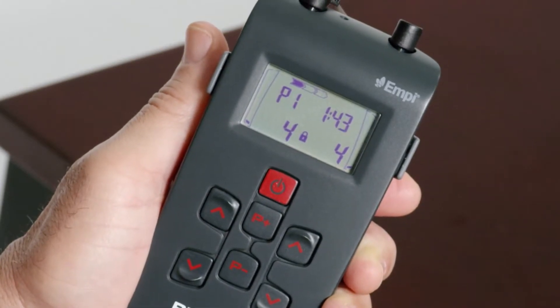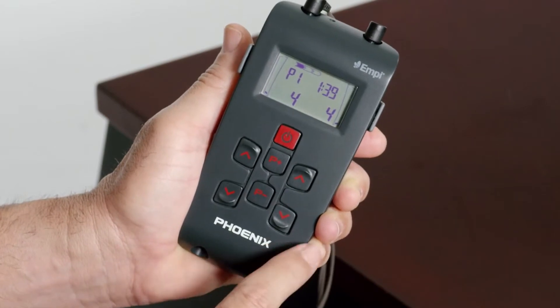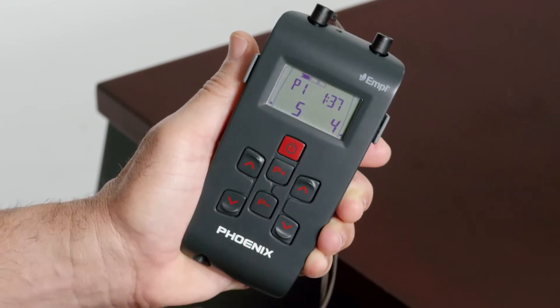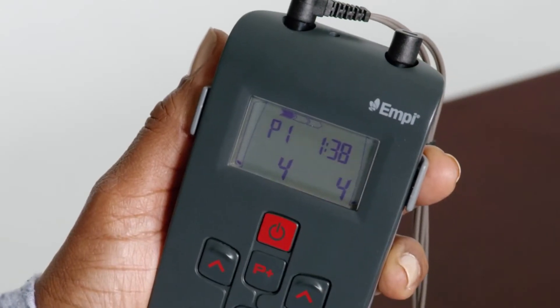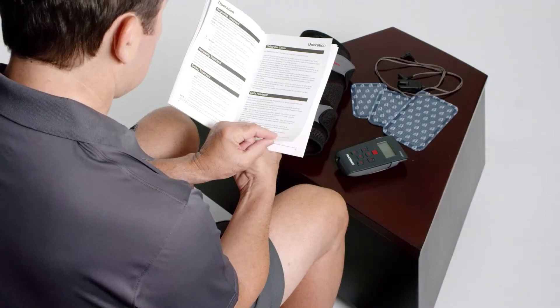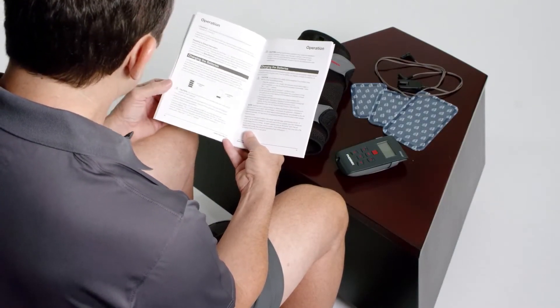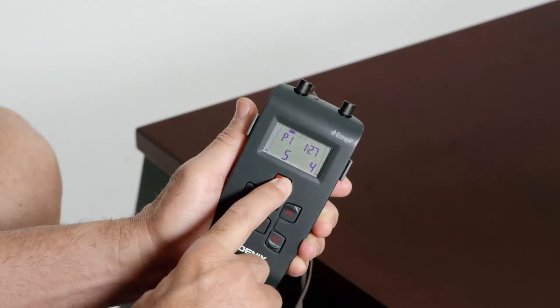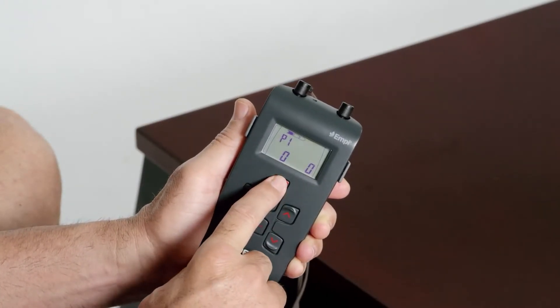To unlock the intensity, first press the down arrow button. The lock symbol will disappear and you can now increase the intensity. The device will display your treatment time during therapy. For an explanation of the other symbols on the device screen, consult your instructions for use manual. When your therapy is complete, power the device down by pressing and holding the power button.